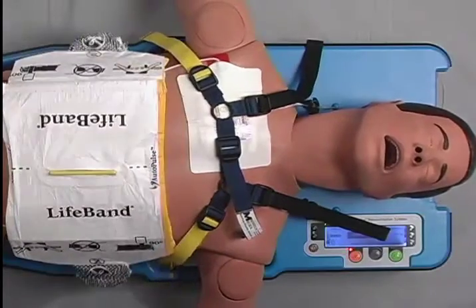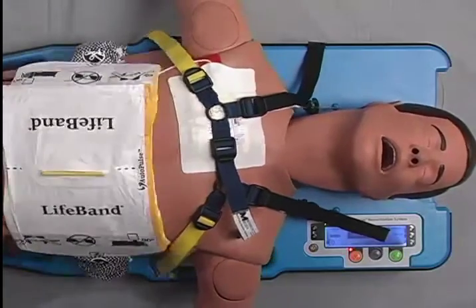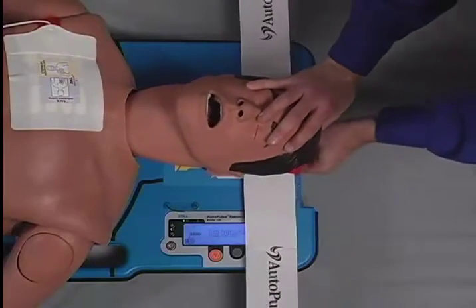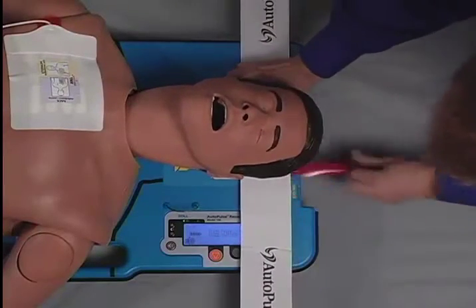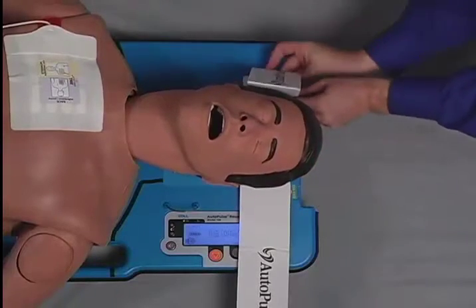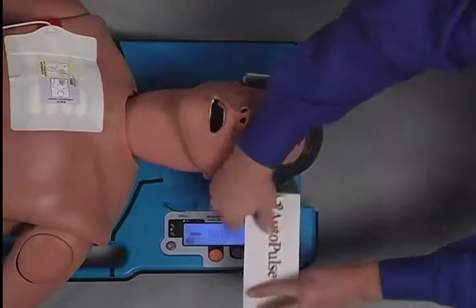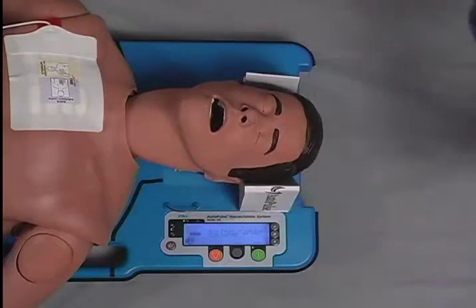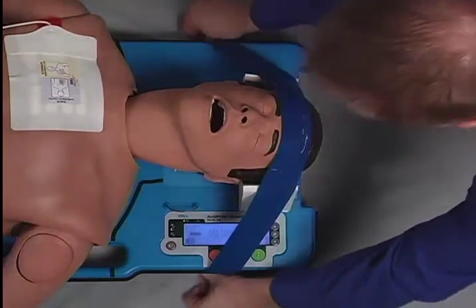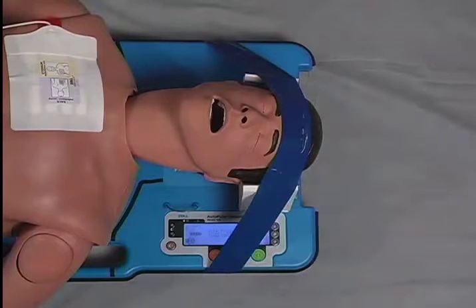It is not necessary to stop the autopulse to deploy the shoulder restraint. To apply the head immobilizer, first place it under the patient's head as shown on the diagrams. Fold each side of the support panel with the outer flap folded under. Press down to secure with Velcro. Then tape across the patient's forehead above the eyebrows and secure it to the autopulse platform. Standard head blocks and tape may also be used.